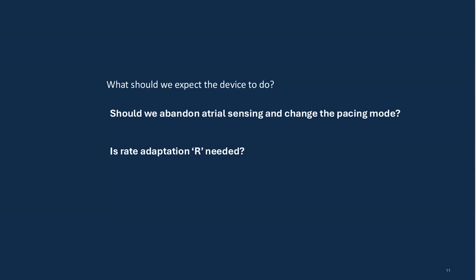Okay. And actually, she needs a rate, but why is it at 110? Okay, already it will be at 110. The mode in this patient already changed to VVIR.